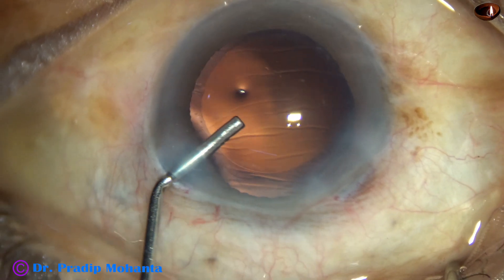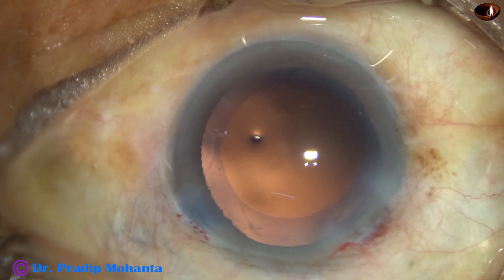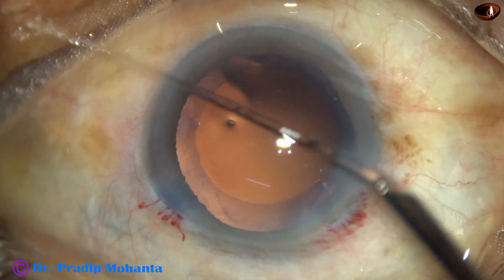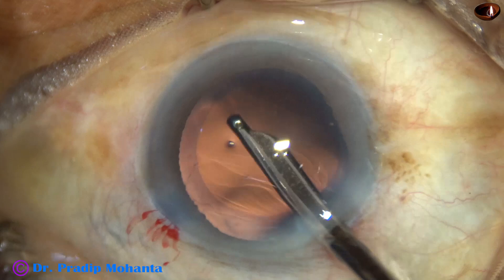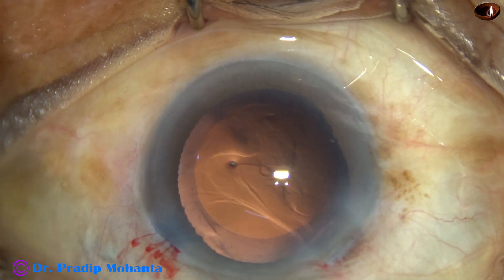Now inject viscoelastic. There is a very small speck of cortex at 5 o'clock and the rest of the capsular bag is free. This small tiny speck of cortex from 5 o'clock is removed.